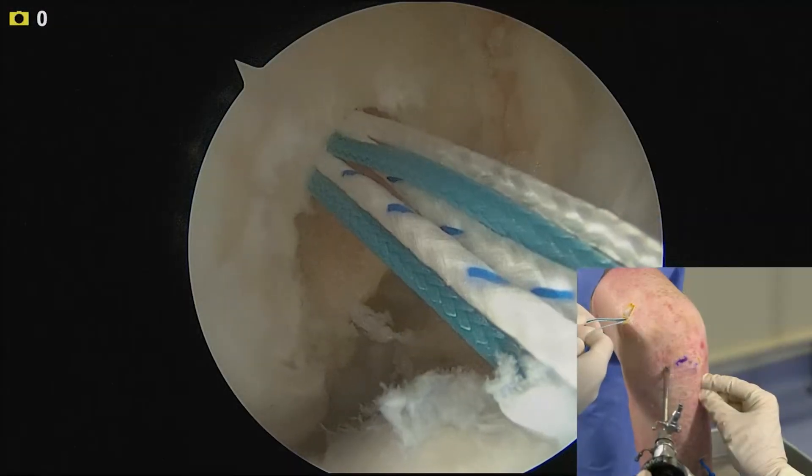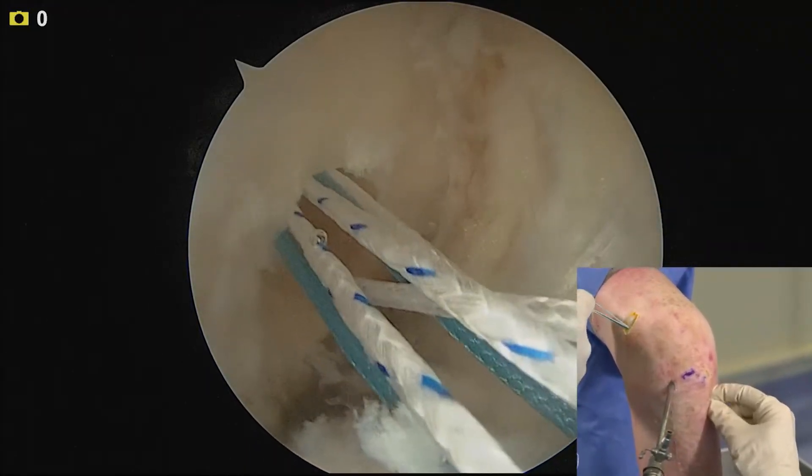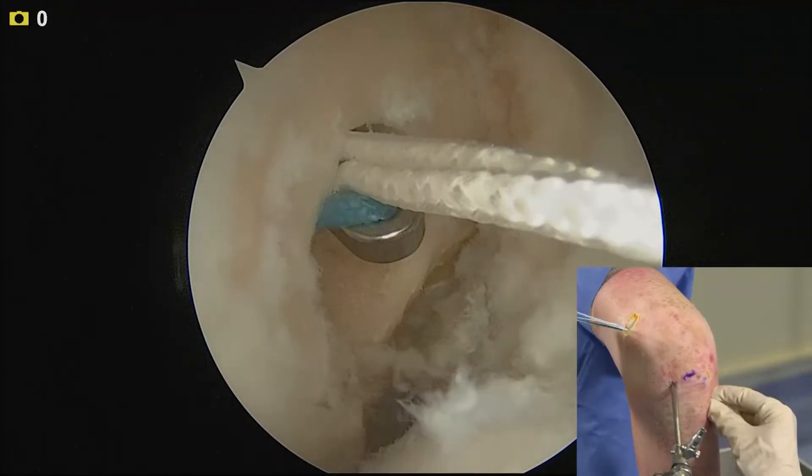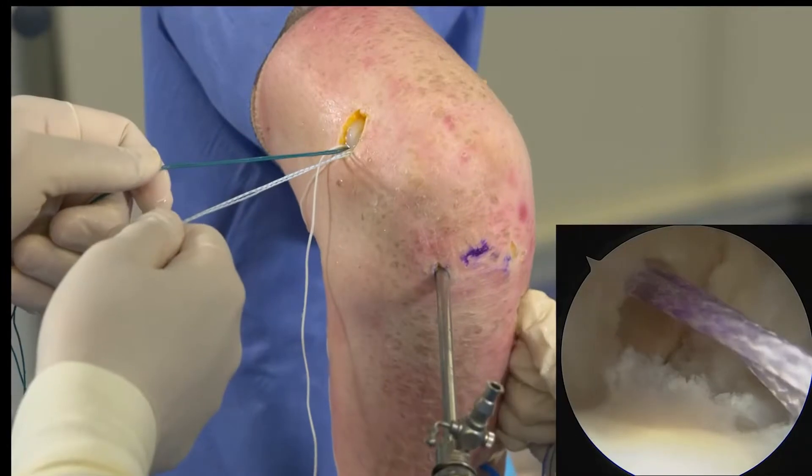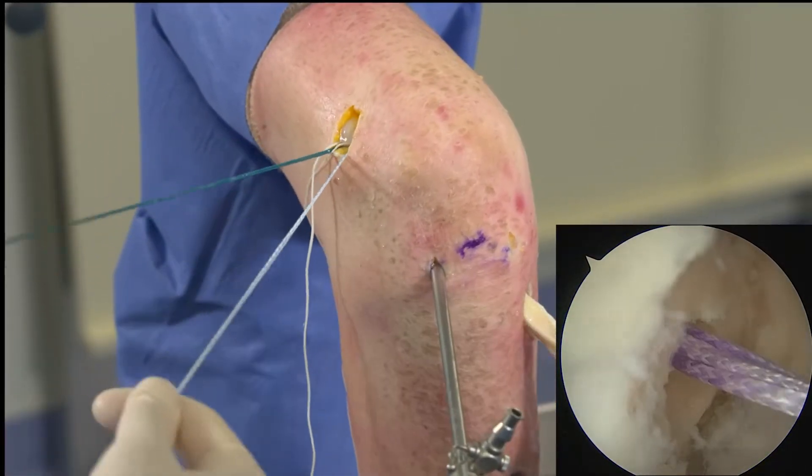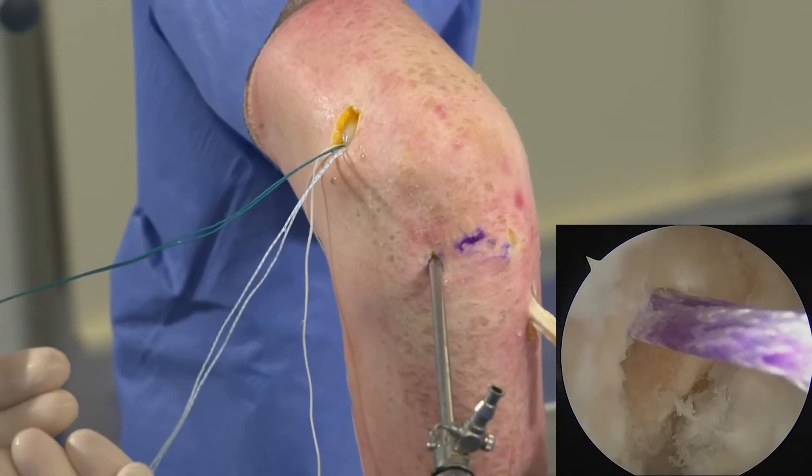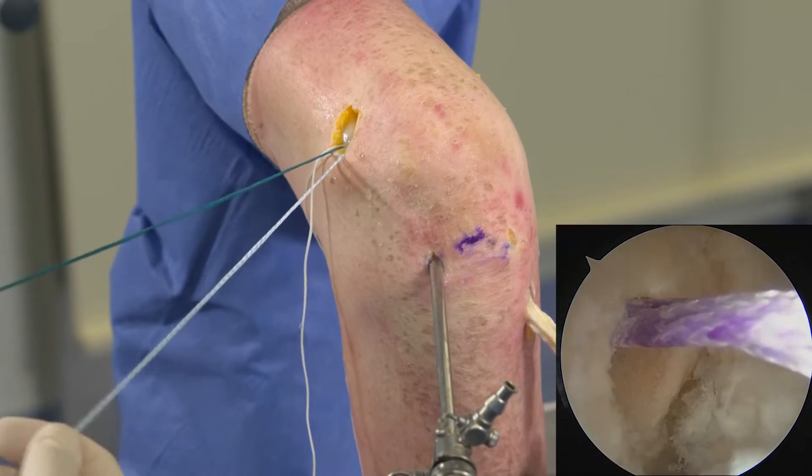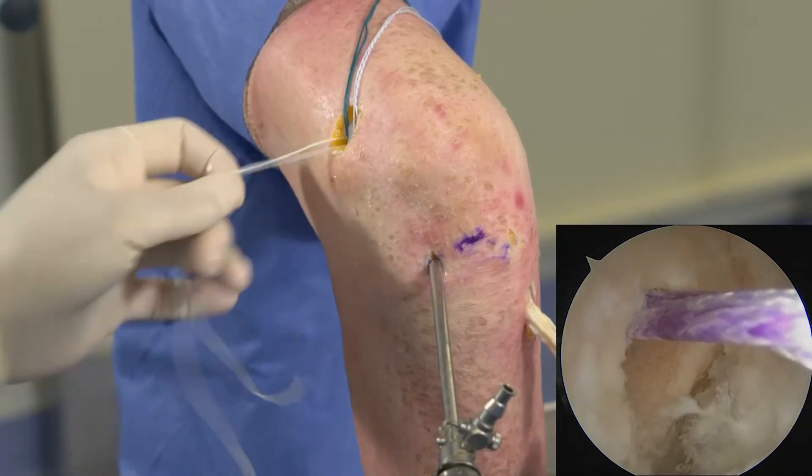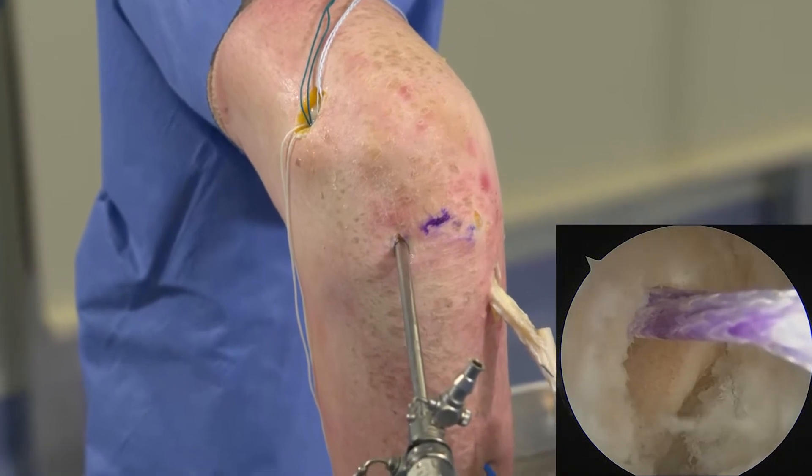At this point we're going to be pulling with the blue and white at the same time taking slack out of the other suture. You can see the blue and white is that leading edge, and once the button is toggled two things are done. One is tension is pulled on the graft to determine if the button is seated in place, and the second way to confirm that the button is flipped on the lateral cortex is to check fluoroscopy imaging, which I would recommend doing every time to make sure that button is flipped on that lateral cortex.